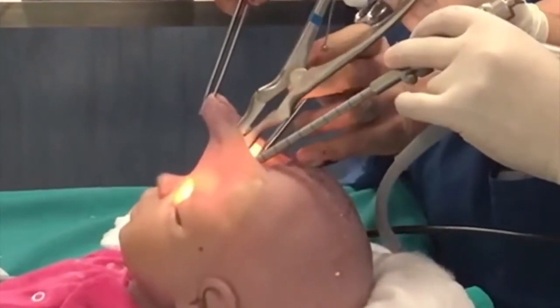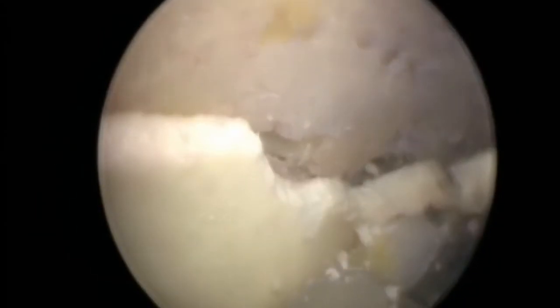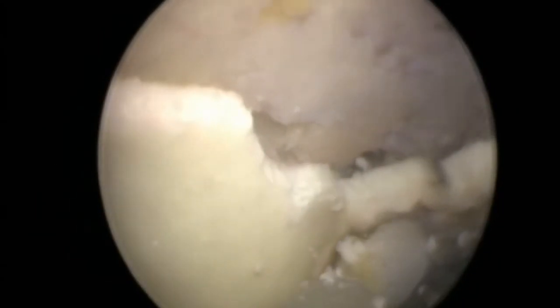It is very important that the bone resection progressively follows the contour of the bone to avoid too much dura and brain compression. Rongeurs, half-bone scissors, and chisels can be used to perform the osteotomy up to the frontonasal suture.